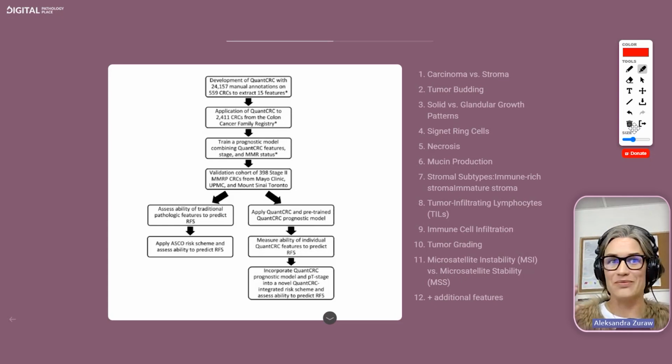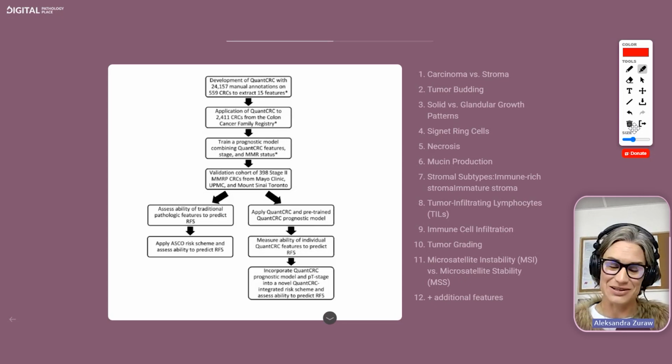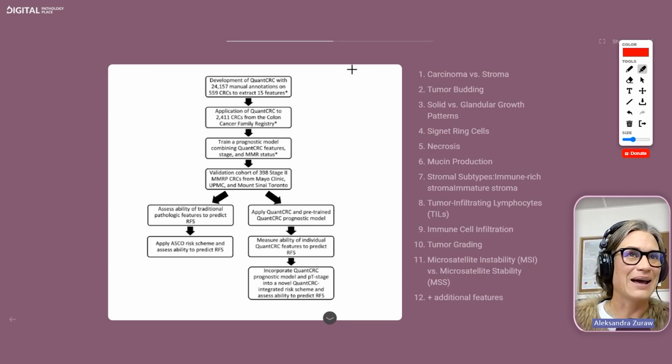And the label came from genomic data, but they didn't put a specific histopathological feature corresponding to the MSI or MSS. They gave the label to the full image. So I thought it was a pretty innovative way of doing weakly supervised image analysis in a software that was designed for classical supervised with annotations. So they included that as well.